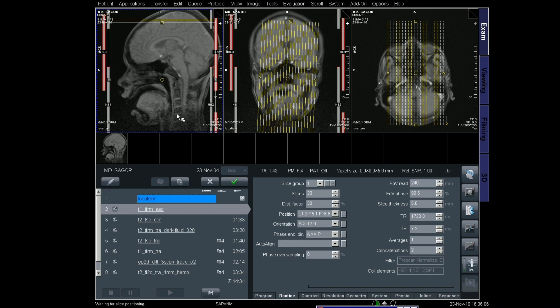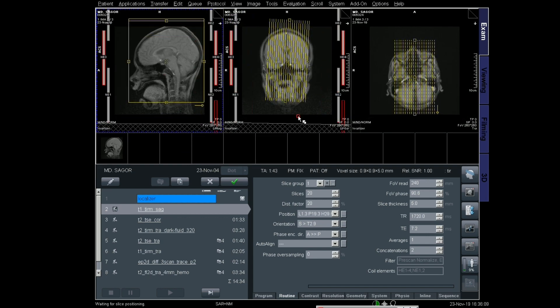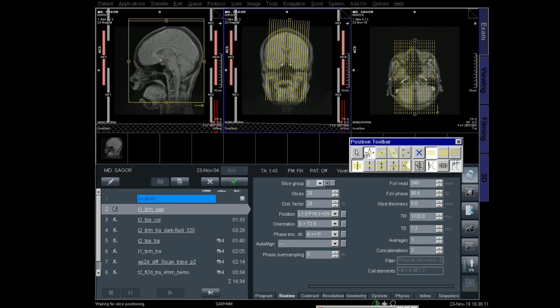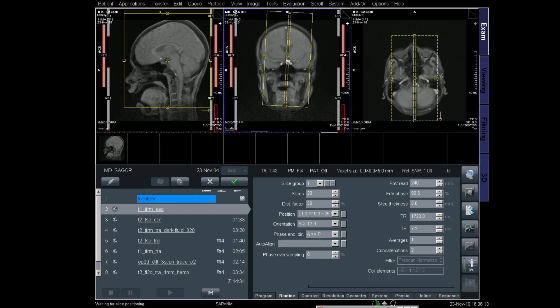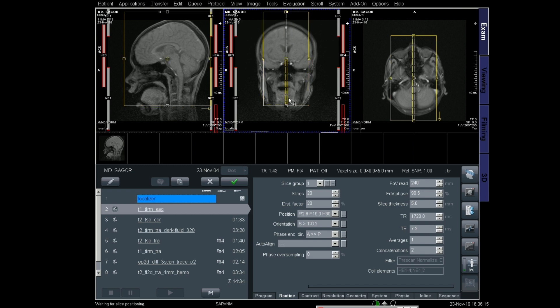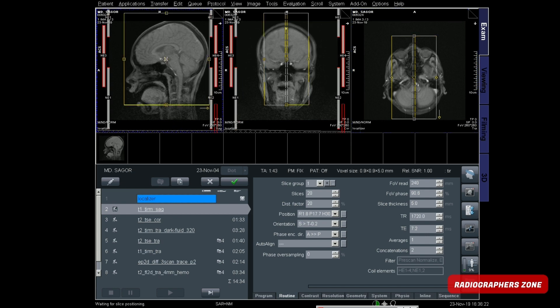The localizer will give us three images: sagittal, coronal, and axial. First we'll plan the sagittal image. We should plan on the coronal and axial images for the sagittal slices.